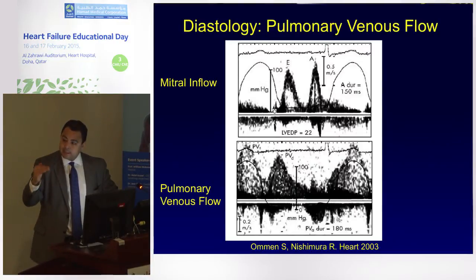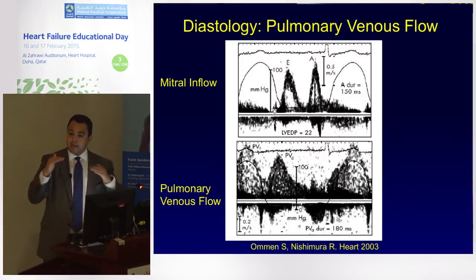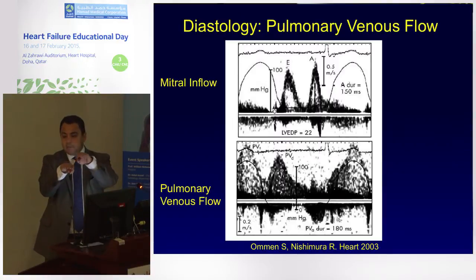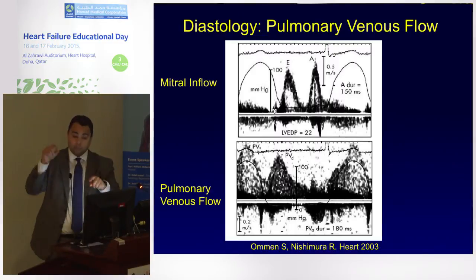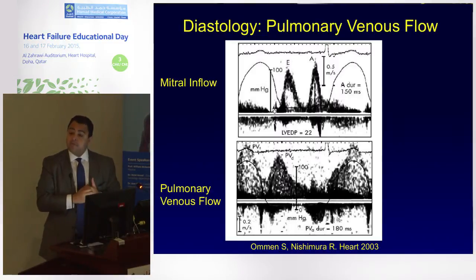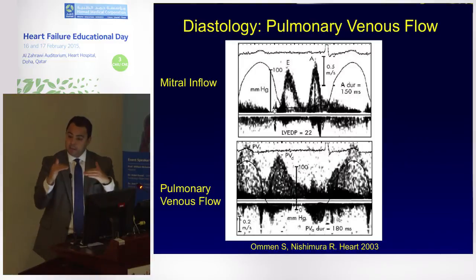As you have impaired relaxation but normal filling pressures, you lose that suction, such that when the mitral valve is closed during ventricular systole your S wave is higher, and then you have lower filling during diastole, the D wave, because of impaired relaxation. However, you then get a pseudonormal pattern in the pulmonary veins. When you have very high mean LA pressure, the pulmonary veins cannot empty into the LA when the mitral valve is closed during ventricular systole, so you have systolic blunting.